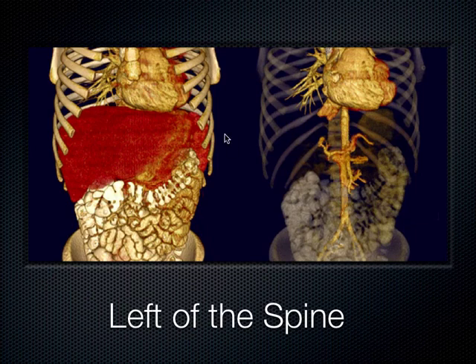This is a really cool CT scan, 3D renderization with the organs on, with the organs off. Very cool technology, I agree. The cost of 500 chest x-rays and radiation. Here is the aorta coming down the left side of the body, correct? Here's the heart. After it comes out of the chest into the abdomen, that's when you can see it. You can't see it up here in the chest with ultrasound. That's one of the limitations of ultrasound. You can't see a thoracic aorta, but you can see abdominal aorta very, very easily. You just keep pushing down until the spine shadow comes into play.